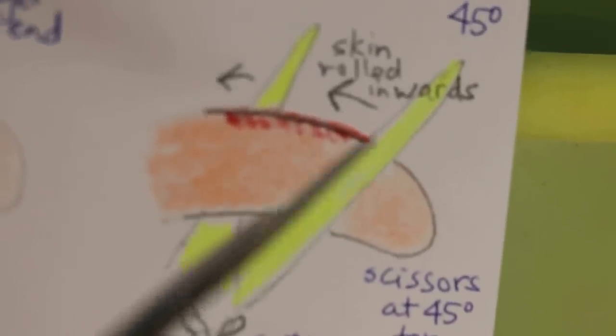As shown in this drawing, the scissors are angled at 45 degrees. You turn and push the skin backwards towards the anus, and then cut. After cutting, the skin which has been pushed towards the anus comes back forward, and then you stitch up below — that covers the bone as well.